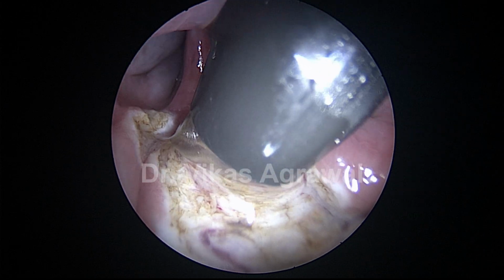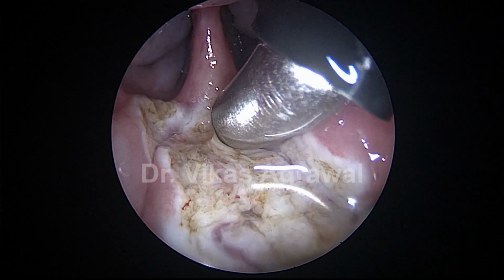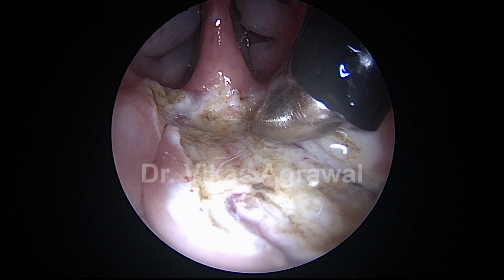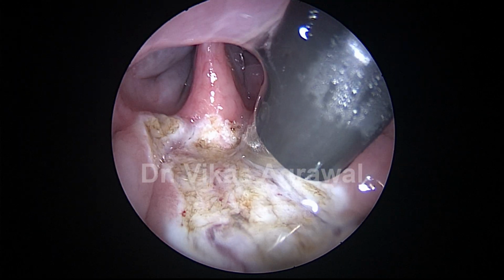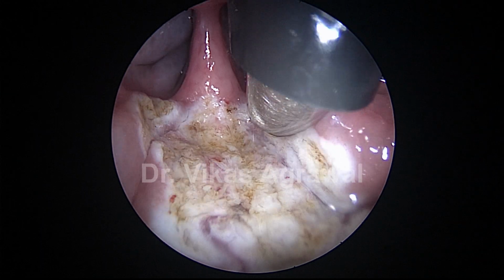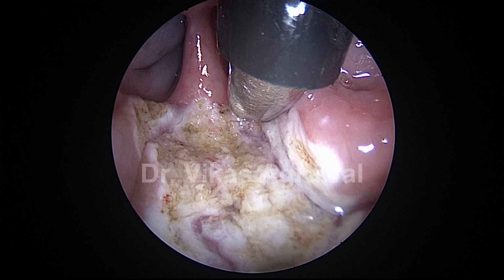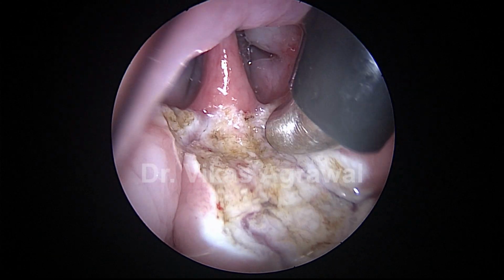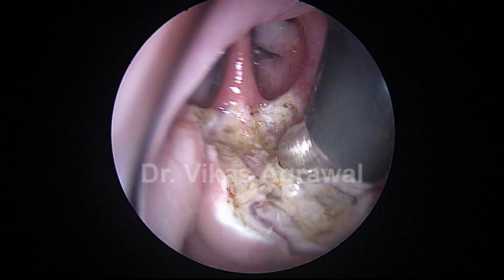I'll keep on removing tissues till I see the periosteum, and that's the periosteum here. This is still the lymphoid tissue. This is the torus tubarius on the right side, and I'm removing the lymphoid tissues from the superior part of the torus tubarius.